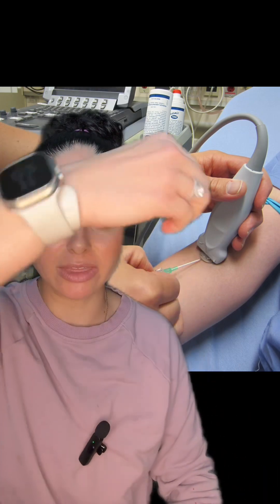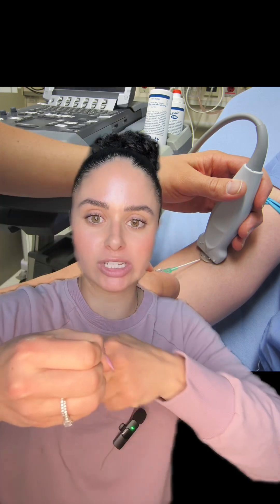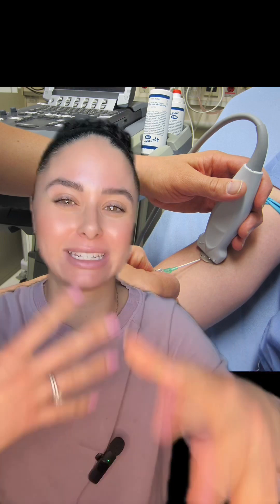I like to get all my IV supplies prepped and ready to go so that when I find the vein I can continue to hold the ultrasound, clean the skin off super well, let it dry, and then while still holding the ultrasound grab my IV and know exactly where I need to go — that way I'm not contaminating the skin and I know exactly where I'm poking. Let me know if you have any questions.